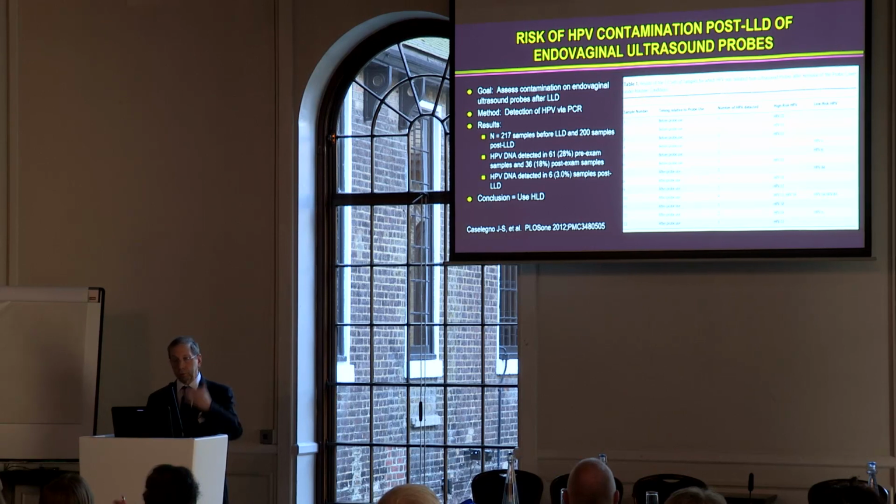So again, the conclusion from multiple studies, multiple people, is that low-level disinfection, even with the probe cover, will often fail, leading to contamination of the underlying probe. And our patients expect that when we use a medical device on them, they understand there are risks of every procedure, and we explain those to the patients. They do not expect to have any chance of acquiring an infection because that device was used on a previous patient.